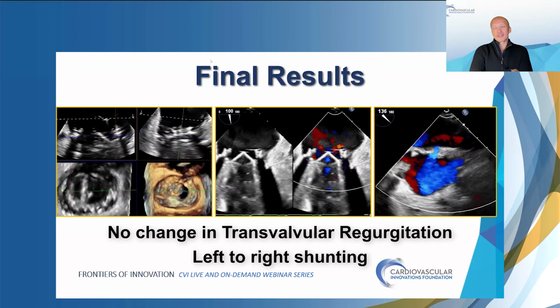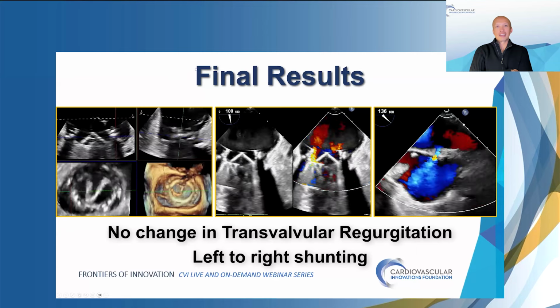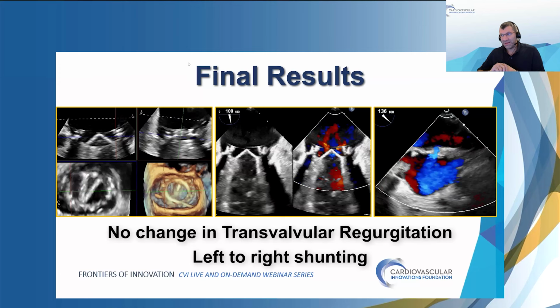It was so much fun. We were hopeful in a cheeky way that maybe we get to do it again. So we left the ASD there open and an infected valve. I think I wouldn't add. Probably all of us would not add a device.